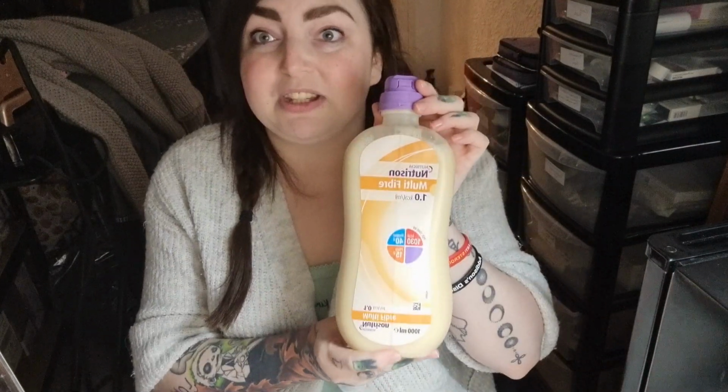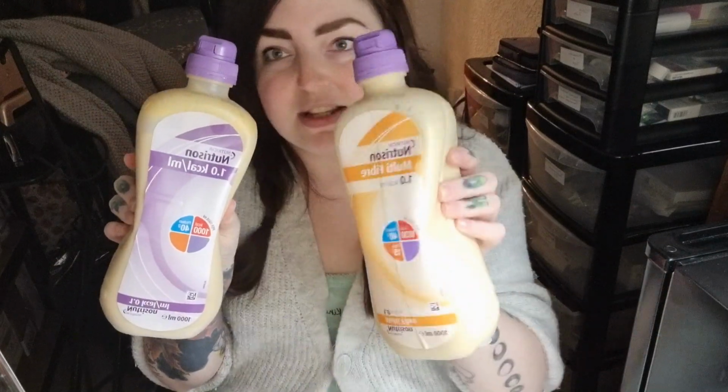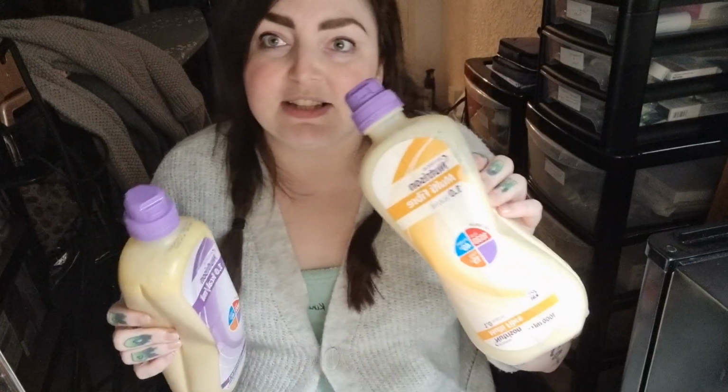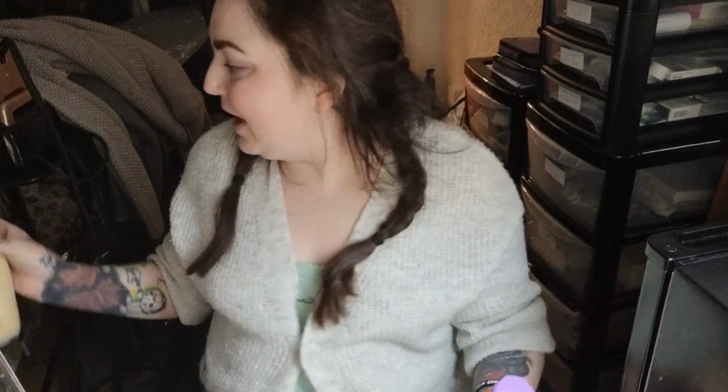Anyway, this is my feed. One of my feeds. So I have two different kinds of feed. One night I take this one, next night I take that one, and so on alternating. If I'm in the hospital, I only take this one because they don't supply this. Because they're rubbish, apparently. So, multi-fibre, where we're going tonight.